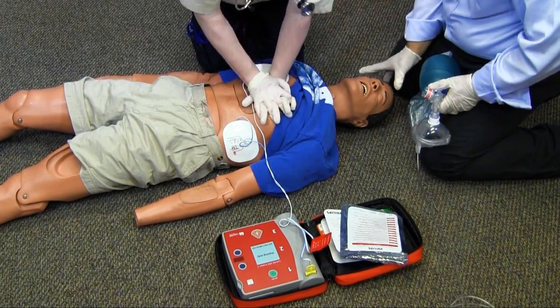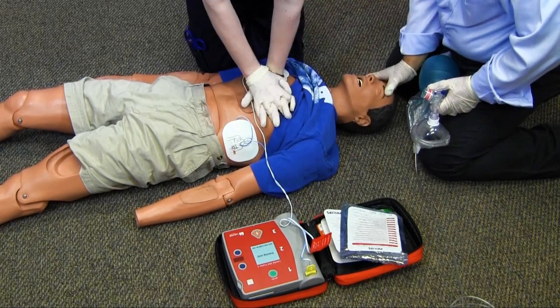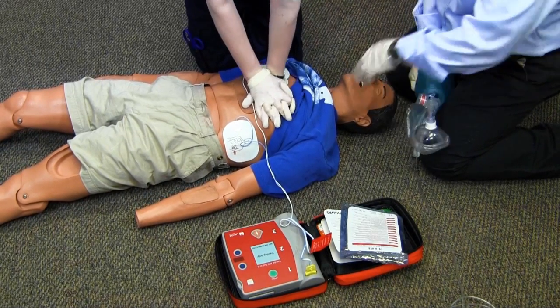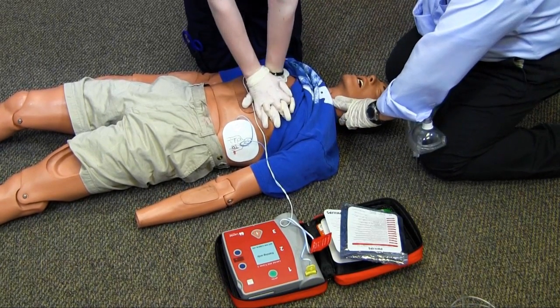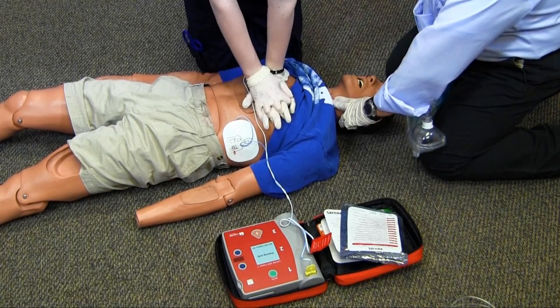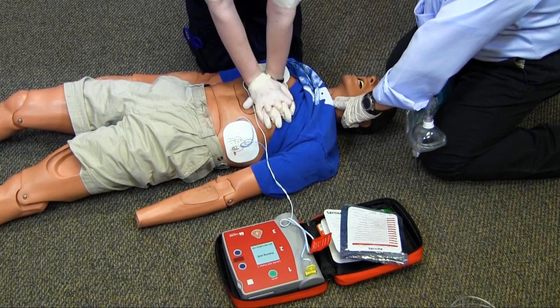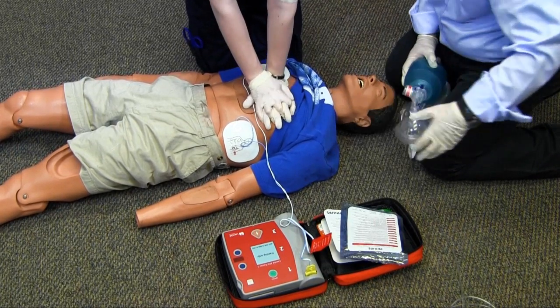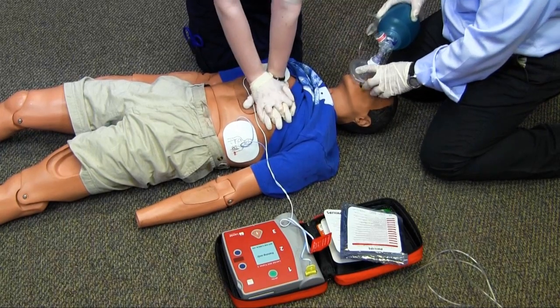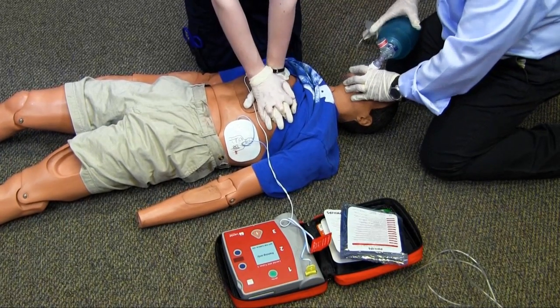My team and I will continue to perform CPR and provide AED shocks until directed to stop, either by medical control or the receiving hospital. Check your local protocols and policies on when it is appropriate to stop CPR.